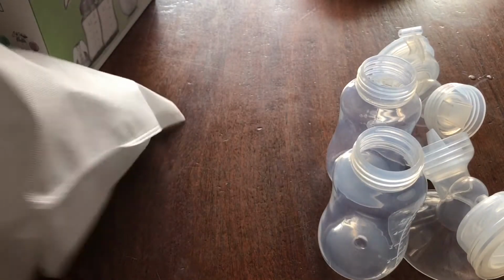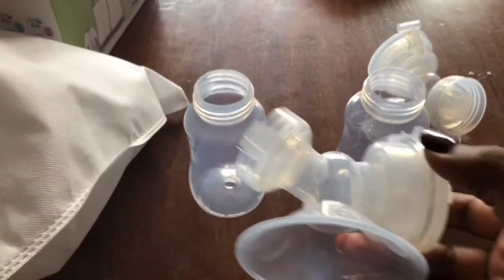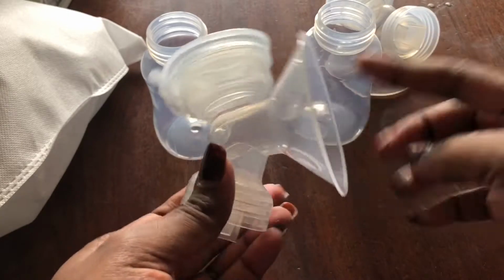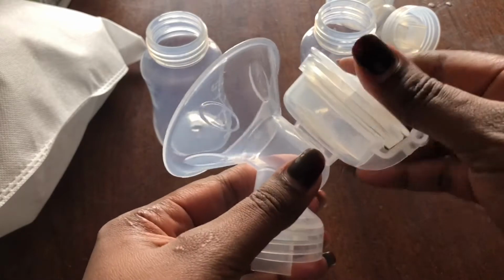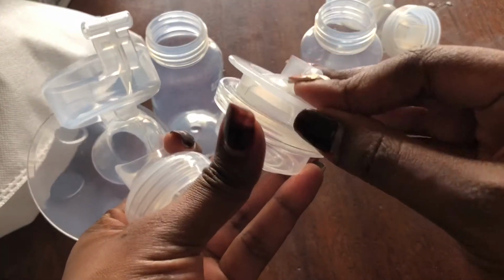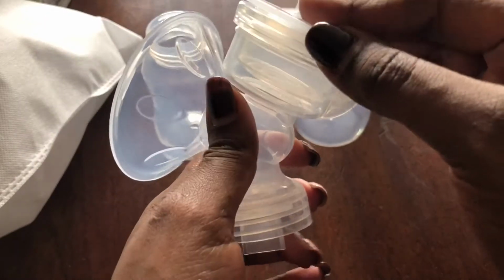So let's deal with this first. So this is how you assemble. First of all, let's talk about this part. So yes, this is how this part looks like. This is where the breast goes in, of course. And then there's this part over here, which has two parts inside, and this is what covers this part over here. This is where you'll see movement like this when you connect it to electricity. So this part goes here.